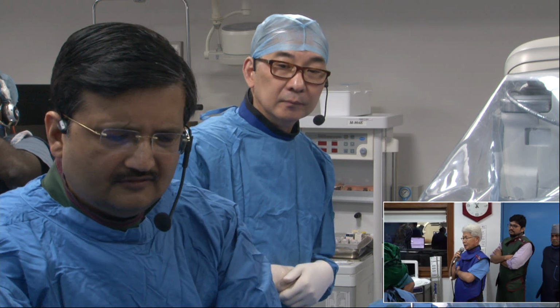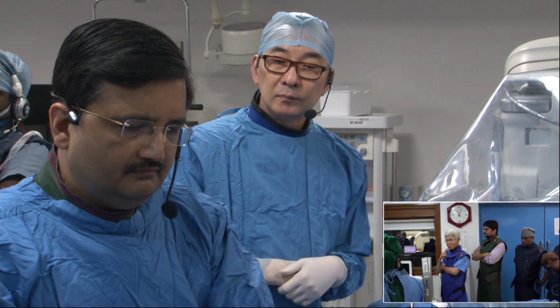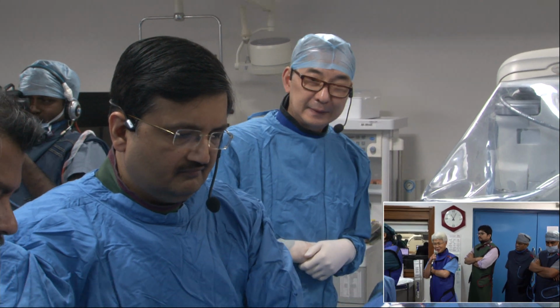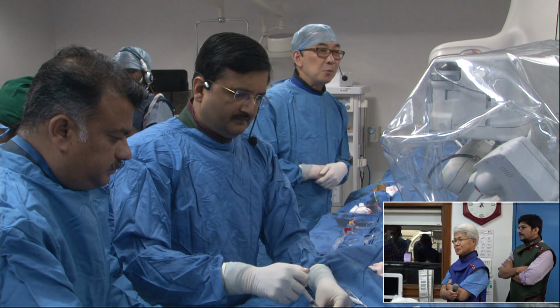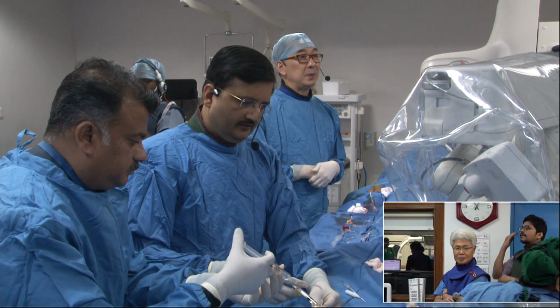But again, I would like to say there are several advantages and disadvantages in both modalities. So you have to choose depending on the lesion which should be better. What is your opinion for the panel? Do you still think OCT is superior to IVUS?